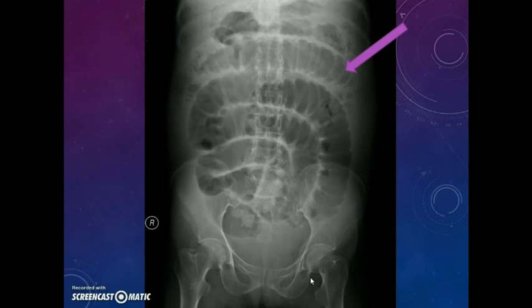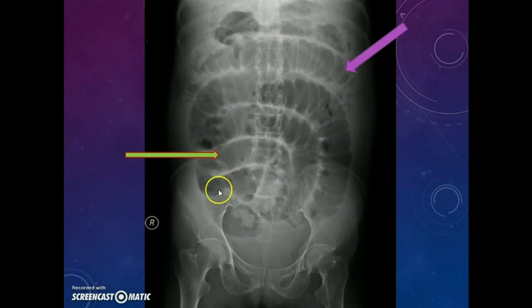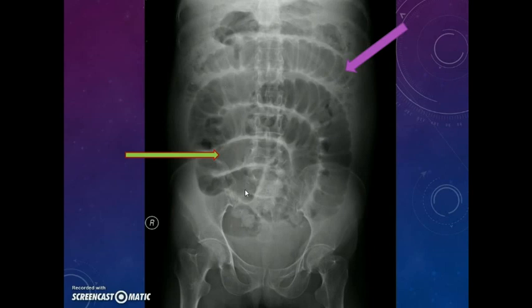We already know that this is the jejunum and we are seeing the valvulae conniventes marked with a violet arrow. Do you see any other bowel in this case? Yes, you can also see the featureless ileum here. The level of obstruction will be in the ileum — the jejunum is dilated, the ileum is dilated, and the colon is not dilated, so the obstruction is most probably in the ileum. Thus we can identify the jejunum and ileum in the abdominal X-ray supine view, and we now know how to identify the stomach, jejunum, and ileum.